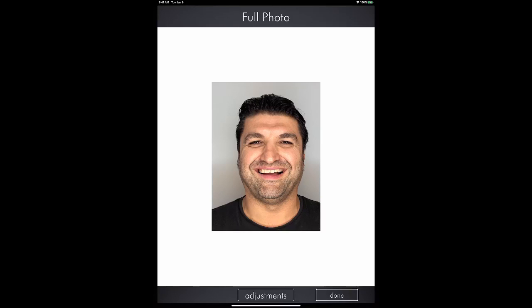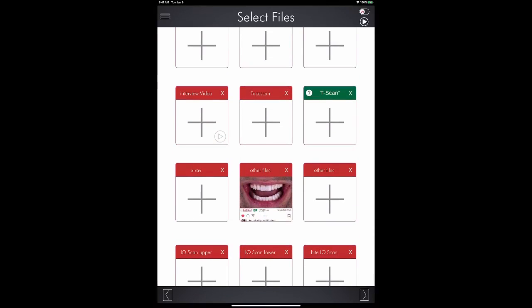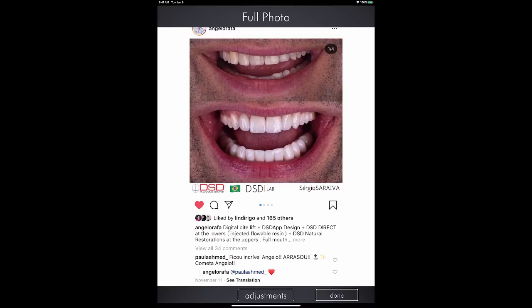As you can see, time, stress, whatever it is, changes your smile. I grind my teeth heavily at night, and with time they changed more and more, right? So I designed my smile with the app, and that's the result.